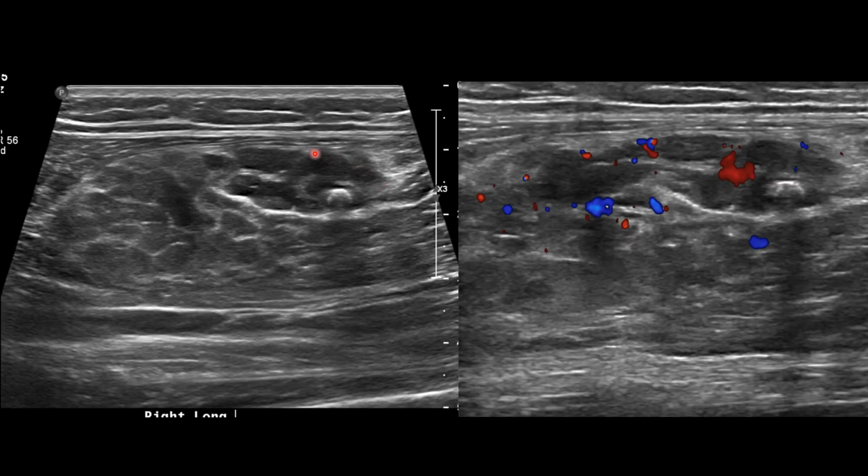In this patient, we did an ultrasound and we see this well-defined echogenic mass, and there is some internal vascularity within the lesion, and we can see a calcification. So we're certain that this is a soft tissue malformation, likely a hemangioma with the presence of a phlebolith.